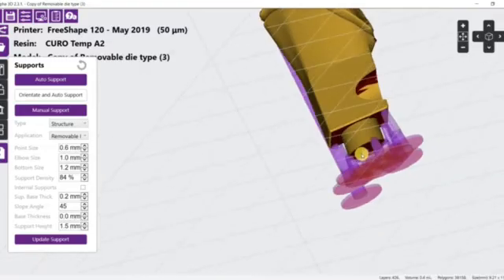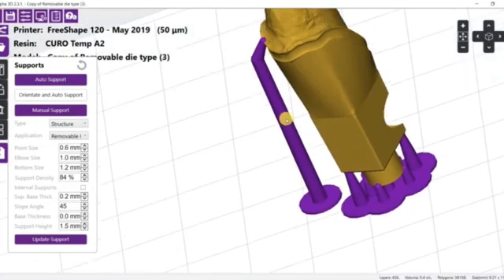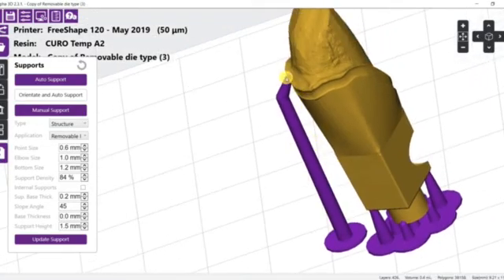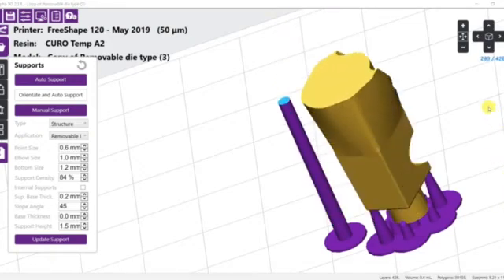This support here is not necessary because this area can be built upon the existing resin layer. So let's remove it.